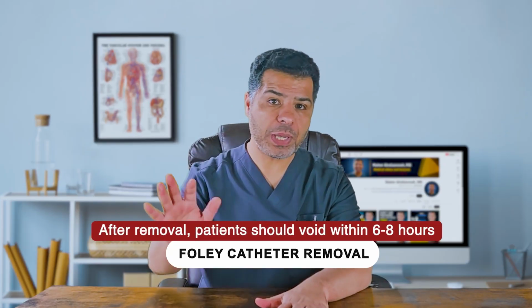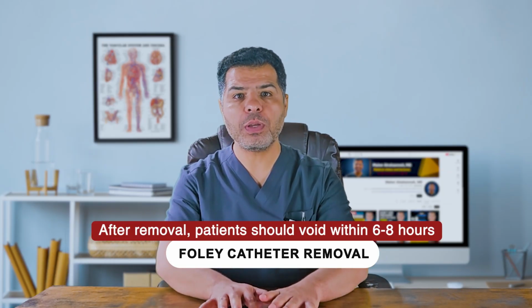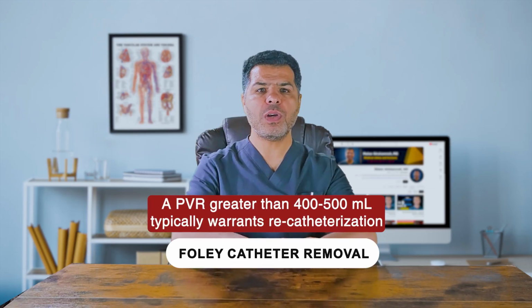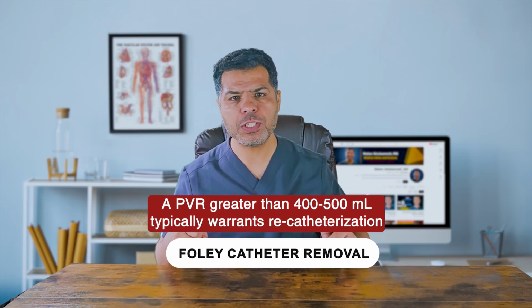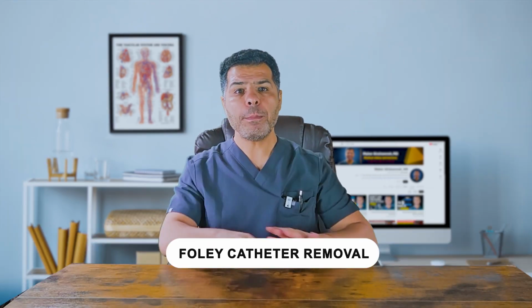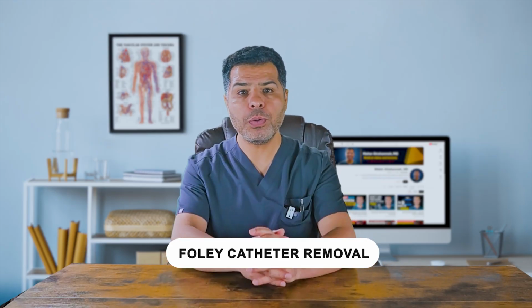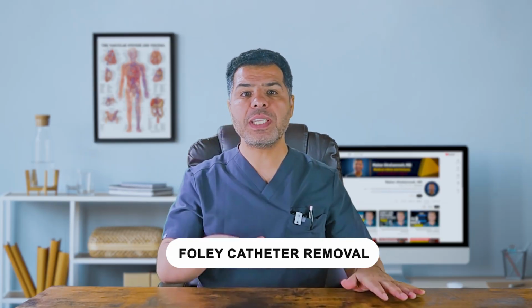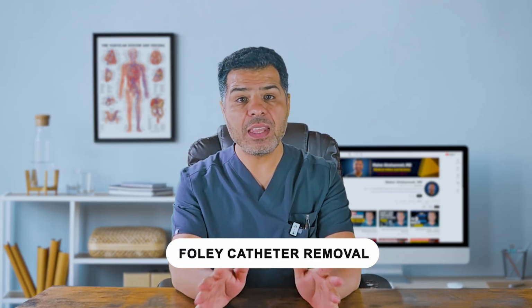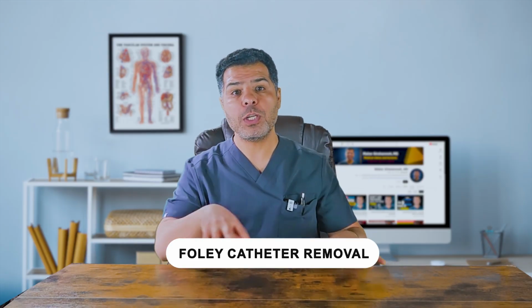Again, after removal, patients should void within 6 to 8 hours, and if they can't or if they are uncomfortable with suprapubic fullness, check a bladder scan. A PVR, post-void residual, greater than 400 to 500 ml typically warrants recatheterization, either straight cath or reinsertion of a Foley, depending on the situation. Some patients, especially post-op or with BPH, may need a trial of alpha blockers or temporary recatheterization. I typically straight cath them twice, and if they're still retaining urine, I reinsert a Foley catheter and then start tamsulosin and arrange for discharge home with a Foley catheter and outpatient urology follow-up.